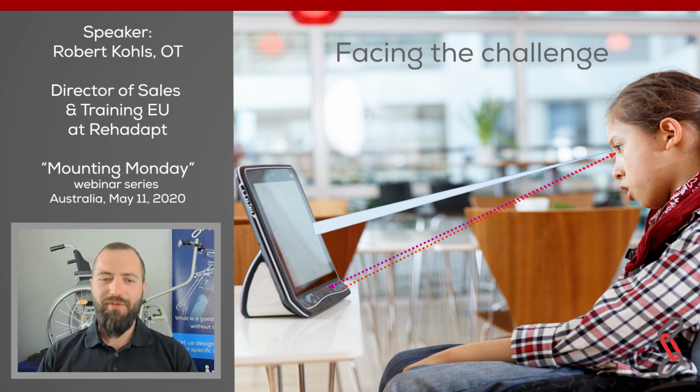I think all of you know that it is extremely important to position an eye gaze device on a wheelchair well enough, stable enough, safe enough, because with a couple of devices it is for sure possible to use them on a table. But as soon as you or your customer want to go out and live independently, if they want to travel, if they want to go outside, it is important that the communication system is not only positioned on a table or on a couple of books, because that will only limit our customers or an AAC user in his independent communication possibilities.